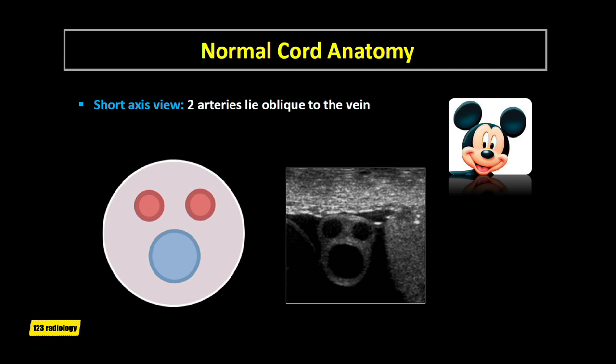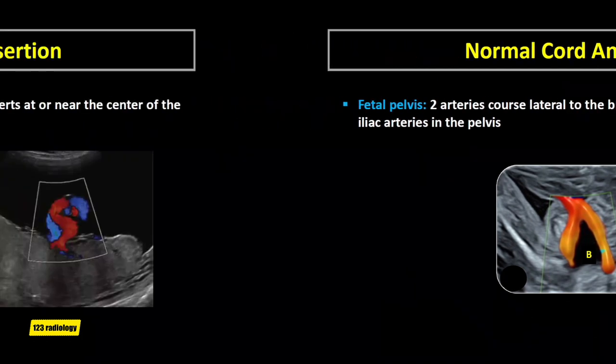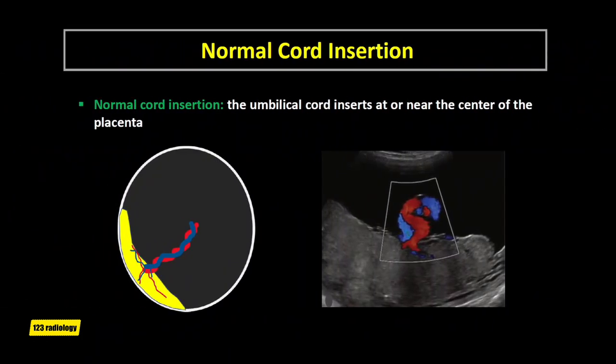On ultrasound of the normal three-vessel cord, the diameter of the umbilical artery is less than 50% of the vein diameter. In the fetal pelvis, the two umbilical arteries course lateral to the urinary bladder and are continuous with the iliac arteries. In normal cord insertion, the umbilical cord inserts at or near the center of the placenta, and in the fetus, the cord inserts at the umbilicus. This ultrasound image shows normal cord insertion in the center of the placental mass.